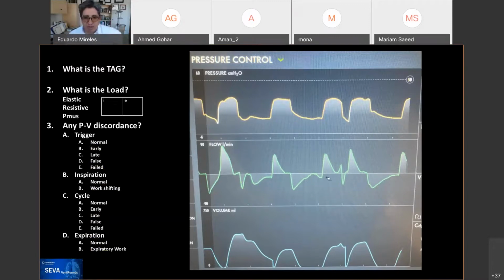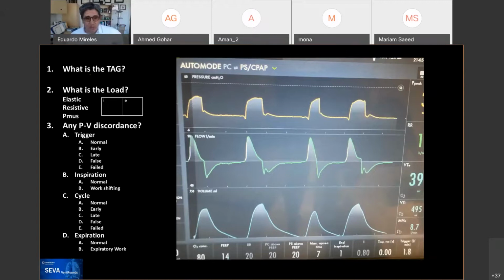All right, and I'll answer Marco's question. So fabulous. What we decided to do is we switched this patient. I want to show you this waveform, which is essentially we put the patient on auto mode, and the tag is PC-IMV, type 2, and is SS. So what was happening to our team is every time they would put the patient on pressure control, the patient would have what you just saw. Whenever they put it on pressure support, the patient would at times hypoventilate, or actually they were triggering another breath. So she was having two triggers.